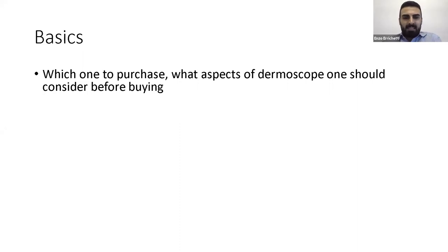Yes. So basically, in my routine clinical practice, I use a hybrid handheld dermoscope. I think this is the best one, because when we deal with an inflammatory lesion, we should use both polarized and non-polarized settings. Sometimes the non-polarized setting may help us see some superficial findings, as previously described in the second lecture. No matter the brand, I think the best choice is to purchase a hybrid dermoscope. Hybrid means it has both polarized and non-polarized modes.